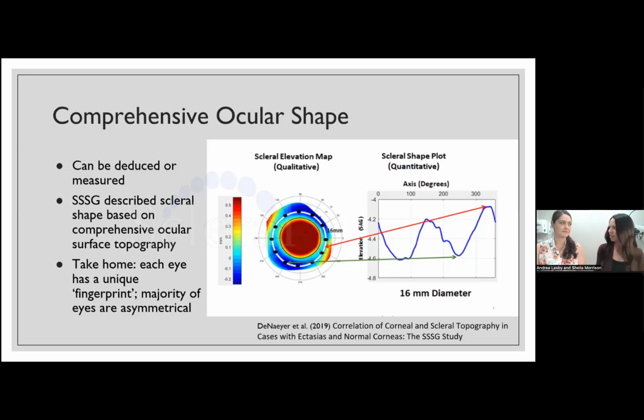Andrea, how often are you using a sphere, a toric, or an asymmetrical haptic right off the bat? What's your usual go-to in the clinic? Yeah. As I mentioned before, I go right to a toric immediately these days. When I did my residency 9 years ago, I remember going to GSLS and talking to manufacturers and saying, I am just fitting torics all day long, every day. And they would ask, hey, how often do you fit a toric lens? I'm like, 80% of my patients are in a toric haptic. And people were looking at me crazy.